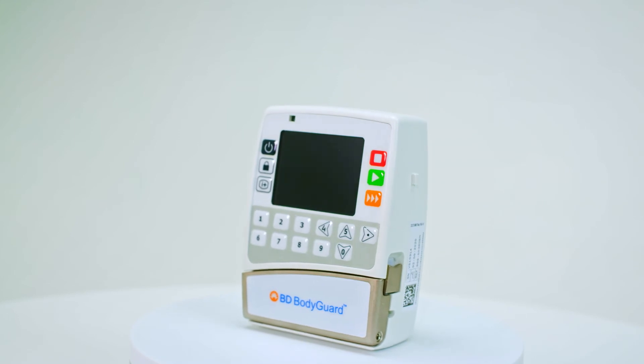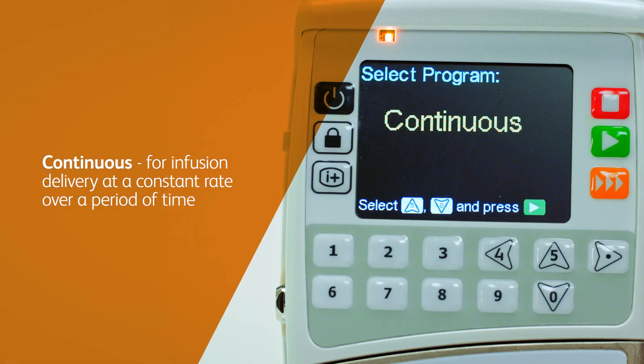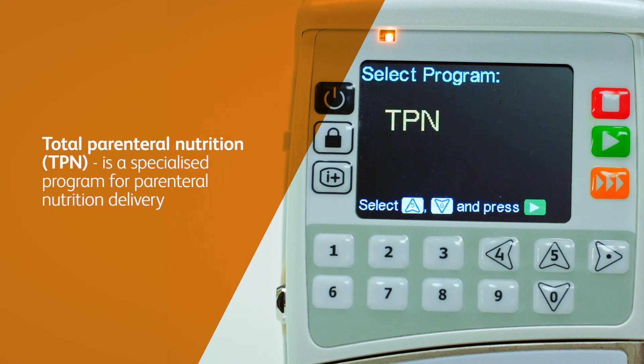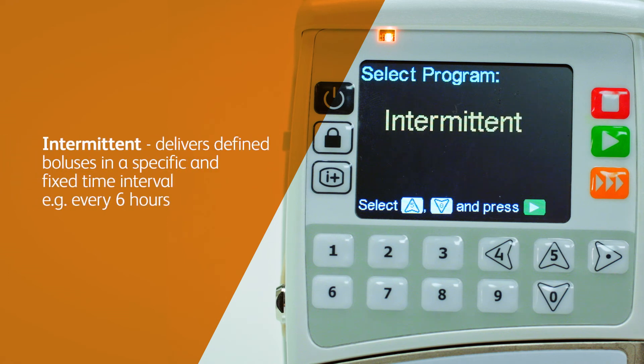The BD Bodyguard infusion programs include: Continuous, for infusion delivery at a constant rate over a period of time. TPN is a specialised program for parenteral nutrition delivery. Intermittent delivers defined boluses in a specific and fixed time interval, e.g. every six hours.